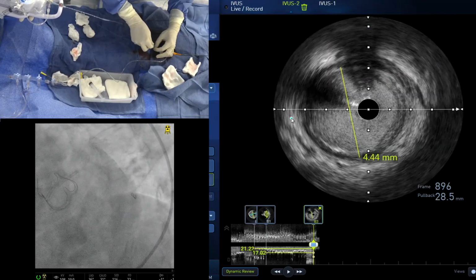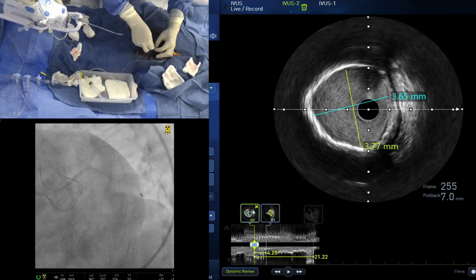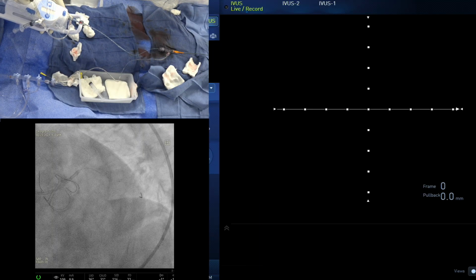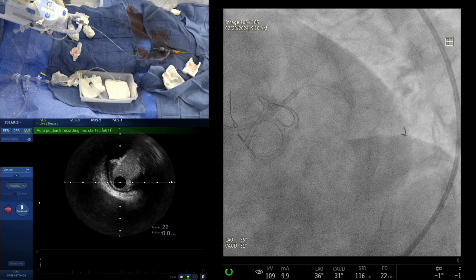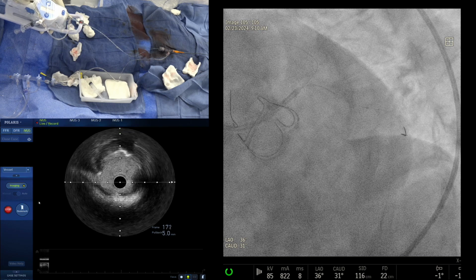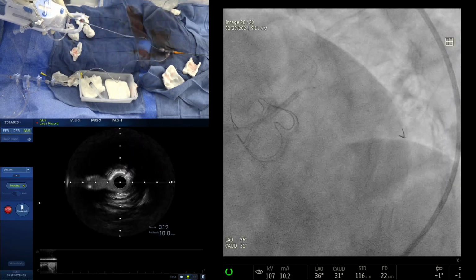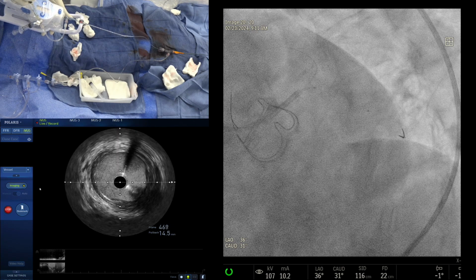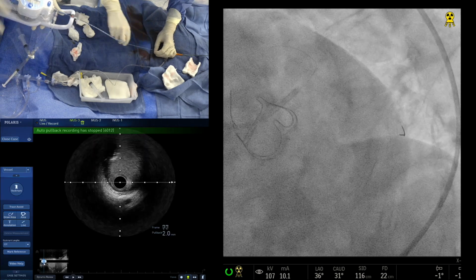after the rotablation. So if we go and put in a stent right away, will it expand? I think it needs further modification with IVL or OPN. At the distal left main level, we just do a little more modification. This is from the circ. Circ is too far. And I think orbital atherectomy can be done ostial circ. Only problem with orbital is it creates a little more wire bias in the angulated lesions, because remember orbital wire is 0.012 inch compared to 0.009.